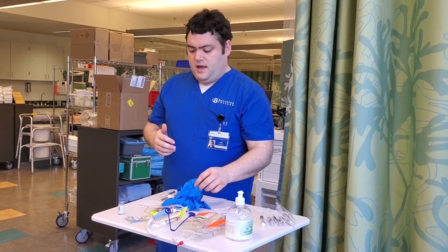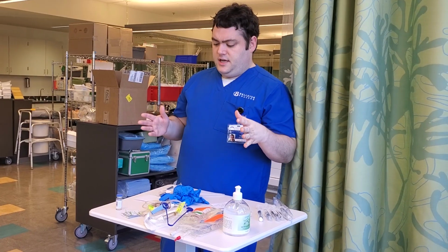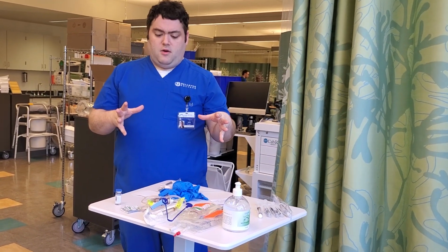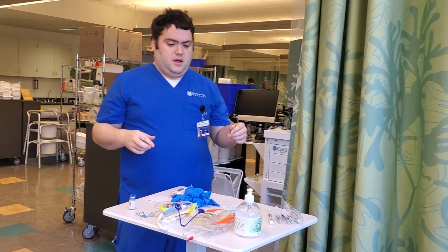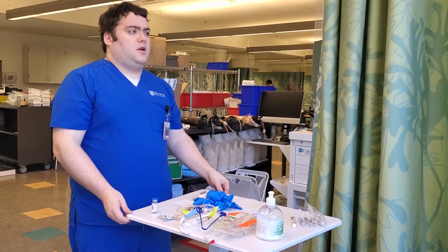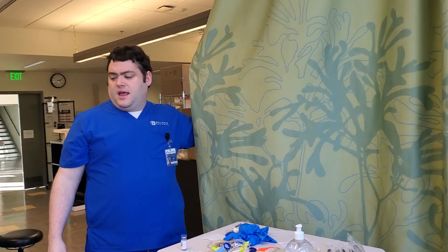So we're going to go ahead and check the expiration dates. I think we have everything we need. We verified in the MAR, so then we're going to go to her room and provide privacy.